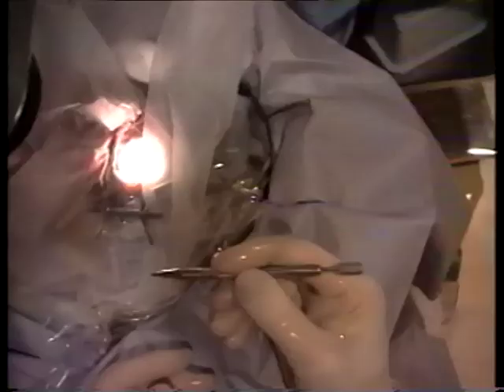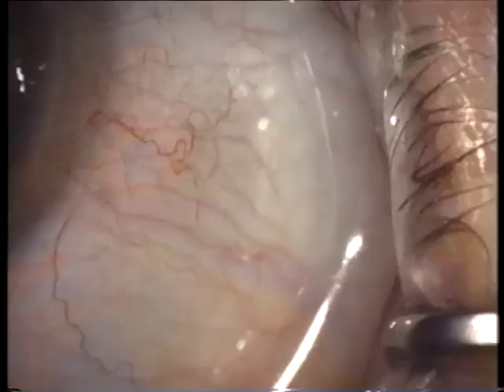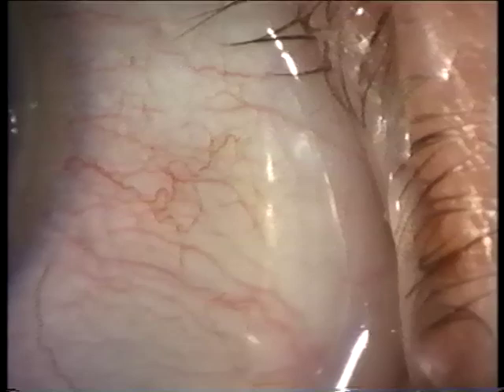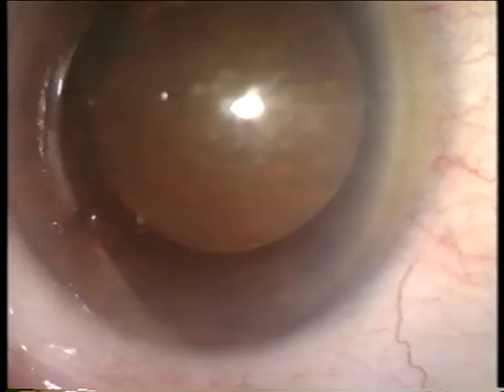Mr. Neal, are you comfortable? Yes. Okay, we're ready to start your surgery. Can you look down just a little bit? Can you find the bright light? Yes. Try to find the light that's straight ahead. Okay.